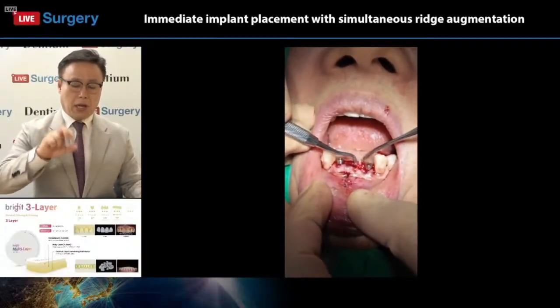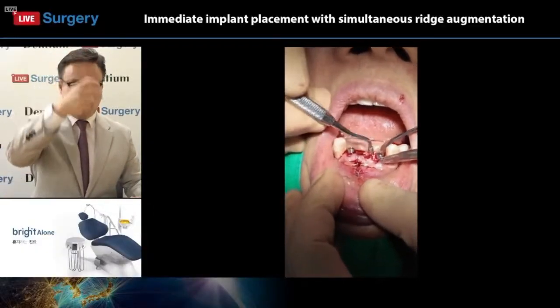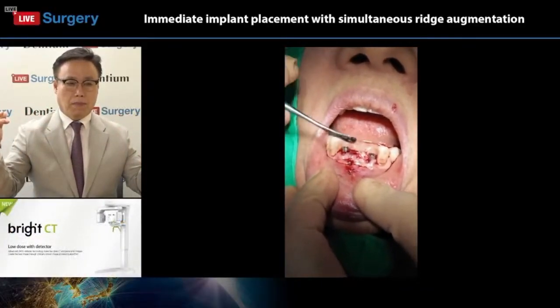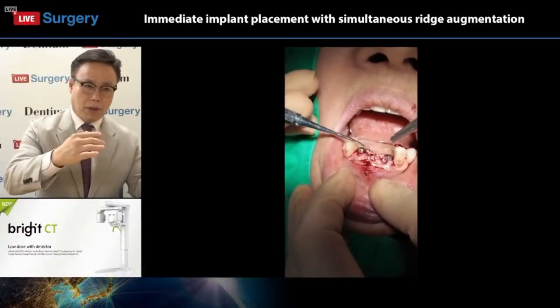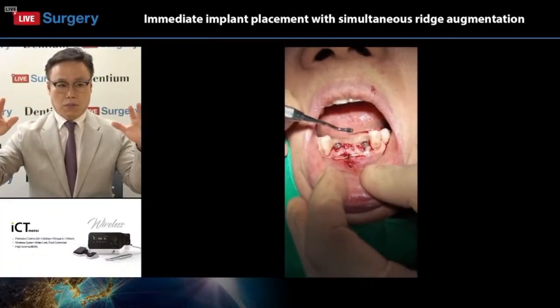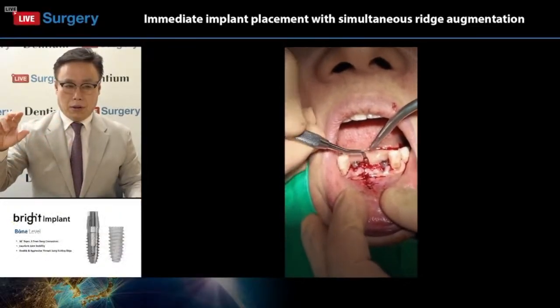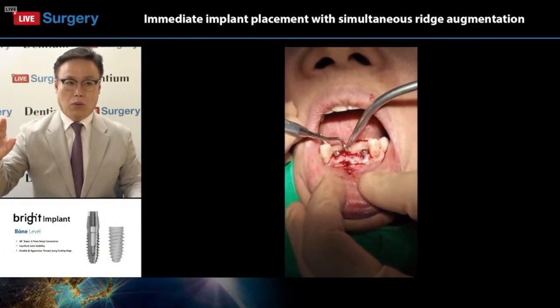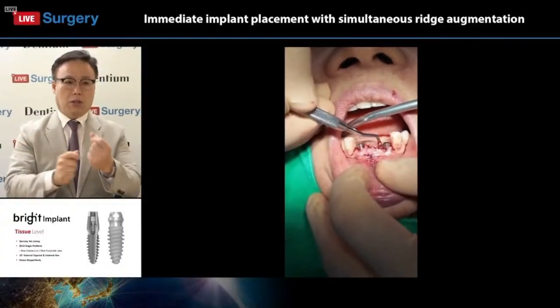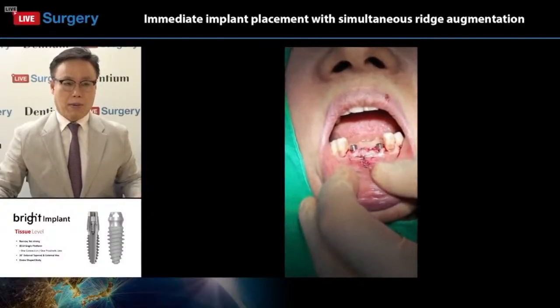We applied the tent pole around the future place for the implant placement. Then the implant was placed, and we applied the collagen matrix membrane, and applied the bone graft, and another bone graft. We placed the implant on the 42 and 32, and applied only the bone graft for the 32, and the bone graft and the membrane for the 42, and finished with the suture and applying the ridge preservation technique for the remaining extraction socket.